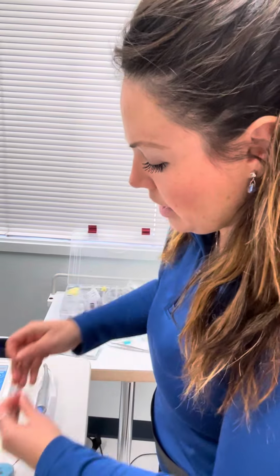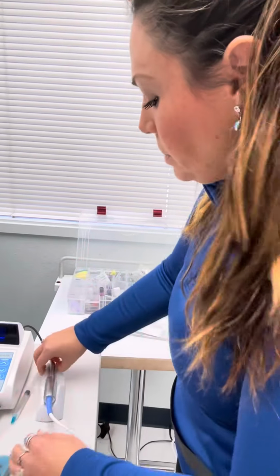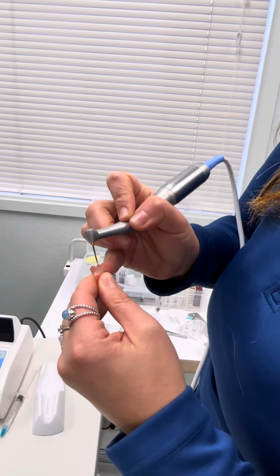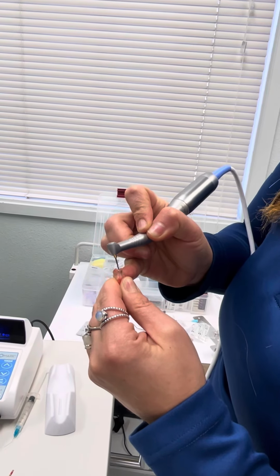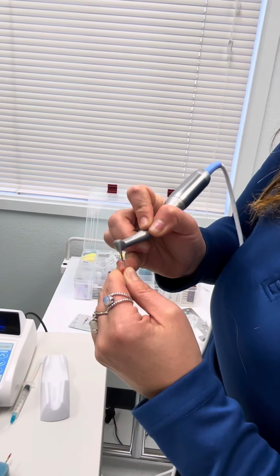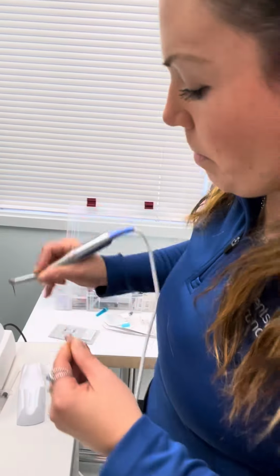Let me make sure that I'm staying on my lingual canal, prepping only my lingual. Okay, so then with an orifice opener, they're going to go in and sweep out. It's really wanting to grab on this one. And sweep away from the furcation. So buccal, lingual, or mesial, lingual, distal.